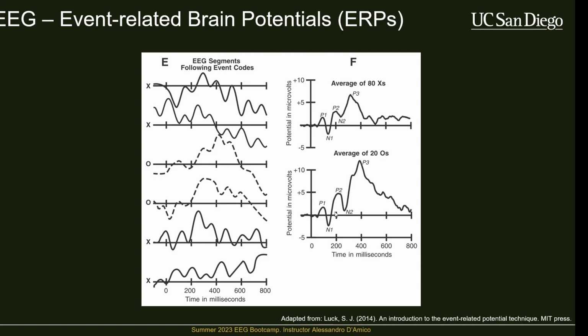And now what you've done is you've systematically manipulated the experiment. It's just science, right? You're applying the scientific method. You're controlling for as much as possible, and you're measuring some dependent variable. In this case, that dependent variable is our EEG activity, and we're really interested in what's happening to that locked to a particular event. In this case, it turns out that we keep seeing this area around 300 to 500 milliseconds changing with these experimental parameters.